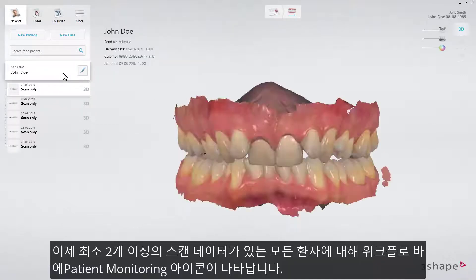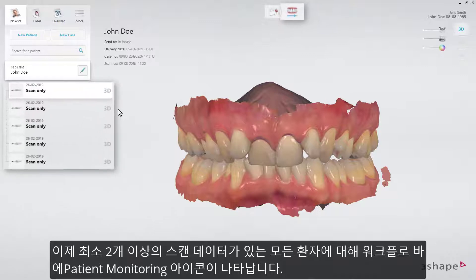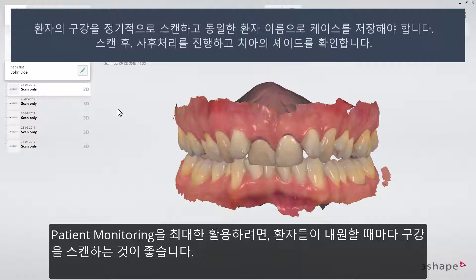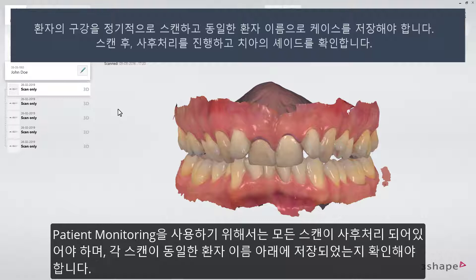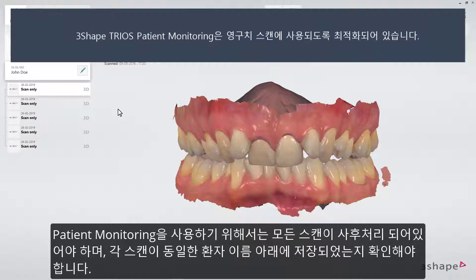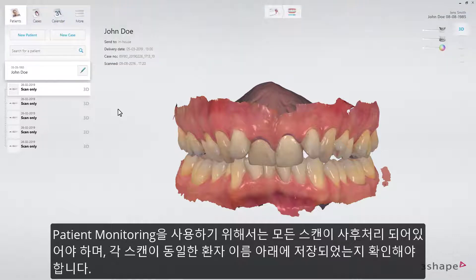For every patient with a minimum of two scans, the Patient Monitoring icon will appear in the workflow bar. We recommend that you scan every patient on every visit to get the most value from Patient Monitoring. Please ensure that all scans are post-processed and that each case is created under the same patient ID.